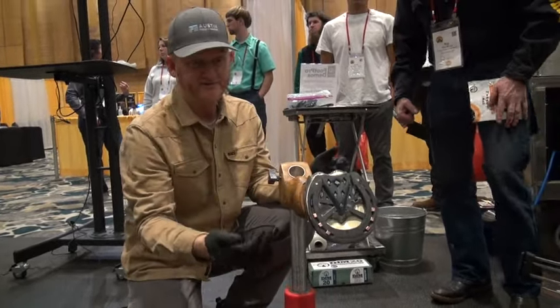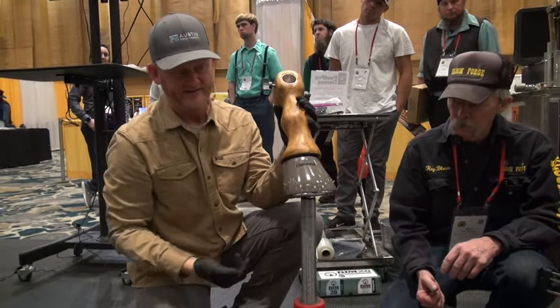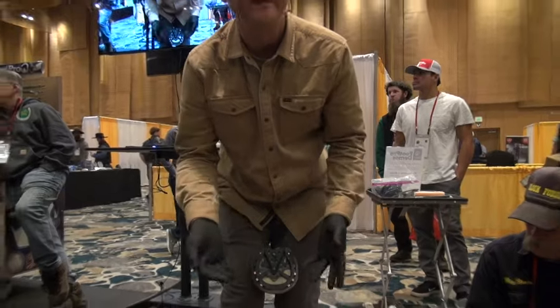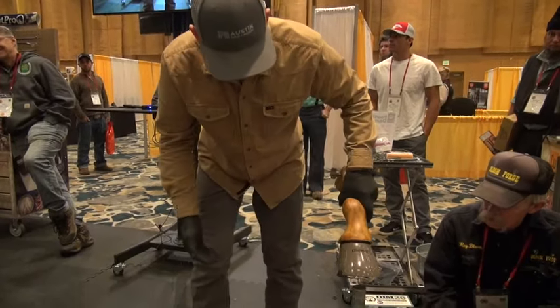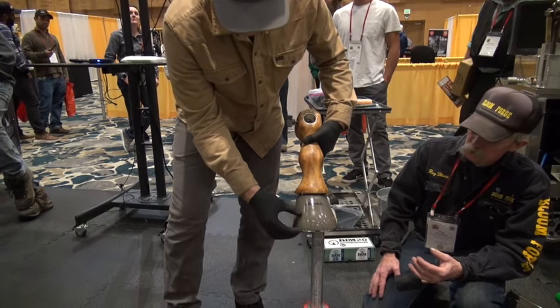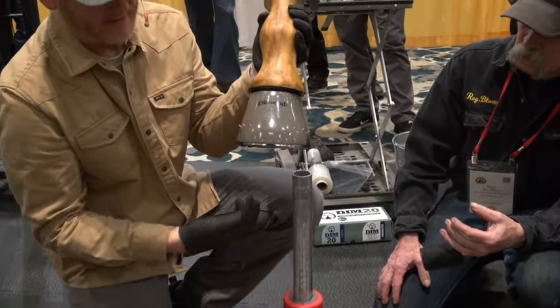We have a bare foot here so the easiest way to apply the cast is forward on the foot stand. The reason for that is I can see exactly what I'm doing. If I try to roll it between my legs I can't see — I end up casting the hairline, I end up casting the bulbs, I end up getting the cast where I don't want it. So the best way I found is to bring the foot forward on the foot stand and roll on the cast around like this so I can see exactly how high up the wall I'm coming. I try to keep it as low as possible, only getting it to the point on the wall where it's needed. If I go way up the wall I'm going to compromise hoof quality sometimes, so I like to keep it on the distal end of the wall as much as possible.